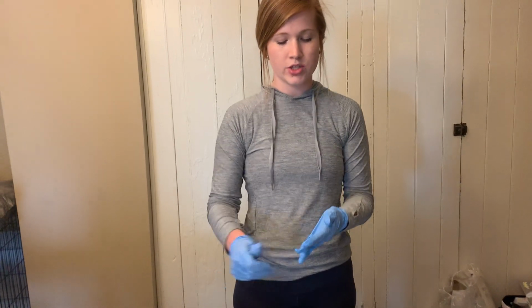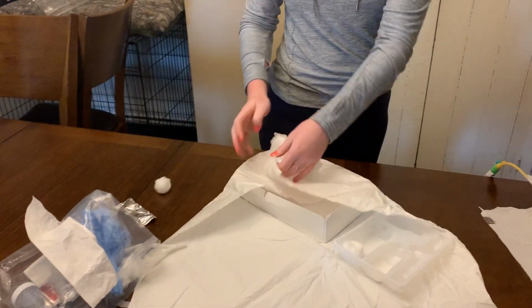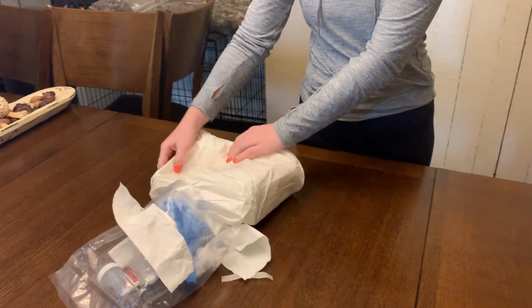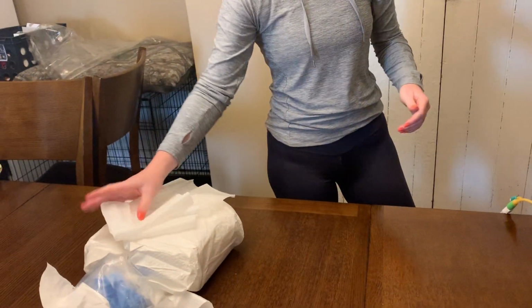After I've done that, I can start to discard my supplies. I can take my sterile gloves off and discard all of this in the proper receptacle. I can take the drape out from underneath, and I can do hand hygiene. Once that is finished, I can document the procedure, documenting how it went, how the patient tolerated it, and record any urine volume or color or odor that I noticed throughout the procedure.